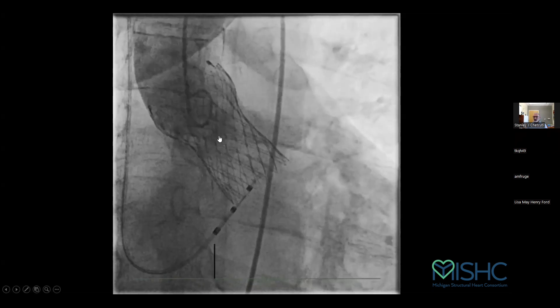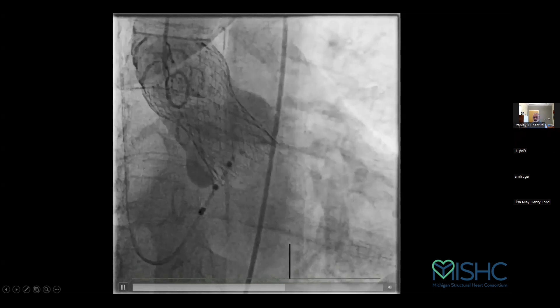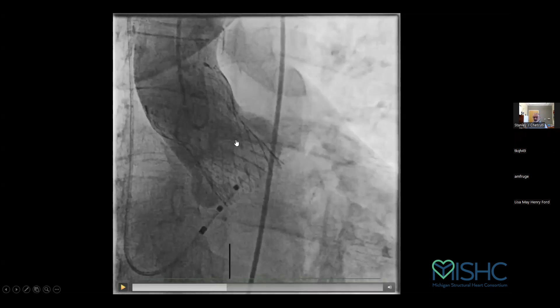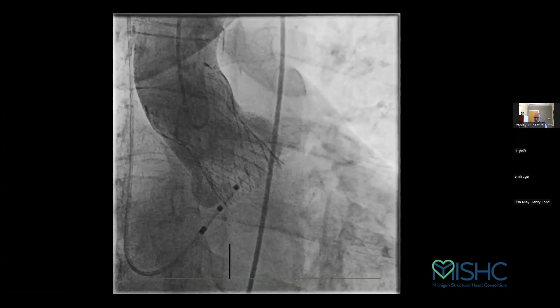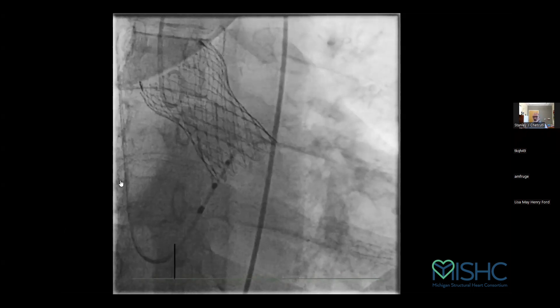You see nice sinus width. The patient is a candidate because we've measured before. The risk plane is going to be here for a second TAVR. We are able to access the coronaries; we have enough space; the VTC is large enough. So this patient not only got a successful TAVR at 65, but has all the characteristics of a TAVR that is amenable to a TAV-in-TAV. That is critically important with new software coming out — we not only plan for this TAVR, but we plan for the second TAVR. Here's the echo at one month — short axis and hemodynamics look great.